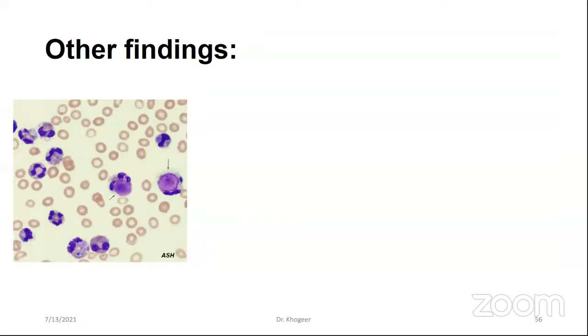That's correct. So this is engulfed material, usually coated by antibodies as LE bodies, and then ingested by a viable neutrophil. And as you can see here, the nucleus of the neutrophil is pushed to the periphery. LE cell is an in vitro phenomenon, rarely found in vivo.